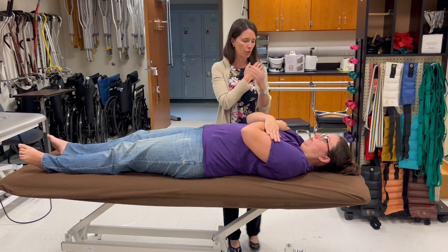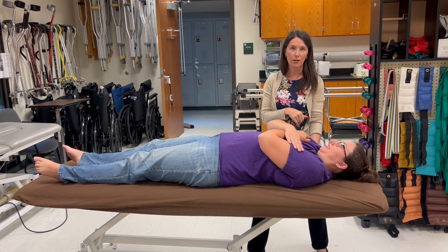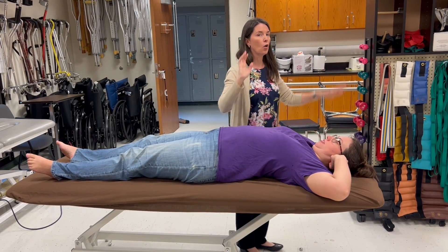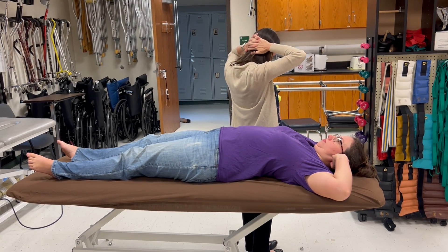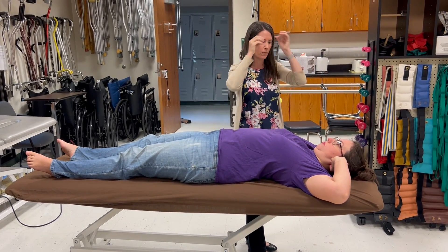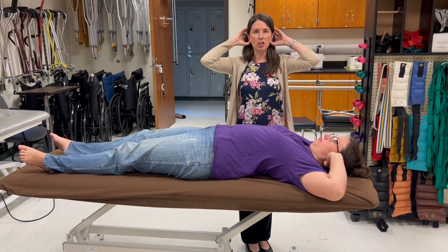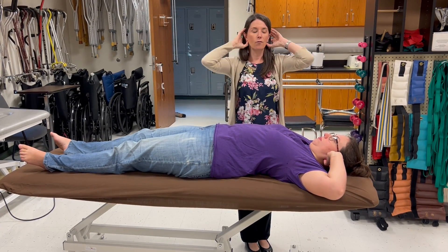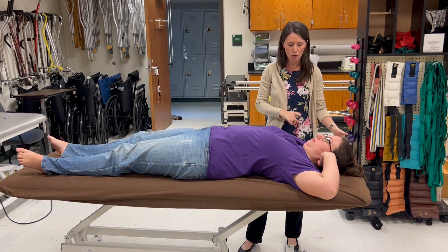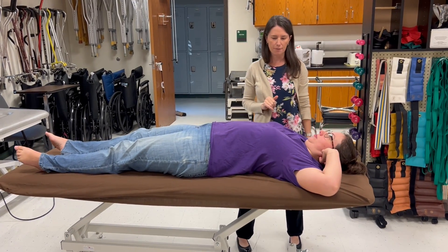For grade four, arms are crossed over the chest — same motion, bring the right shoulder to the left knee. She cleared her inferior angle, so that's a four. For grade five, hands are clasped around the ears. We don't clasp hands behind the head because that gives people an opportunity to yank on their neck. We want to make sure the elbows stay out to the side — same motion, right shoulder toward left knee. She cleared, so she's a five.